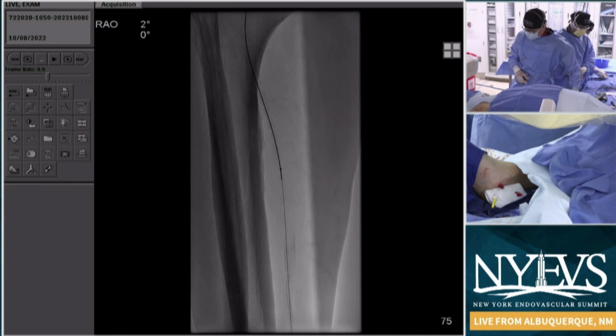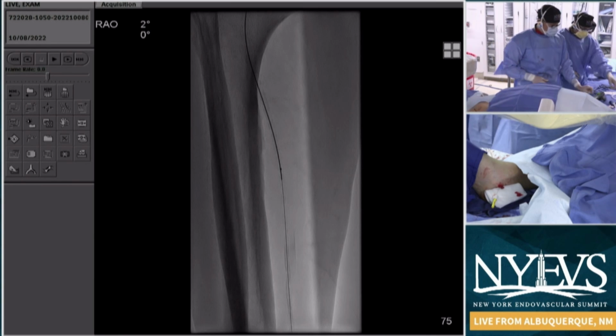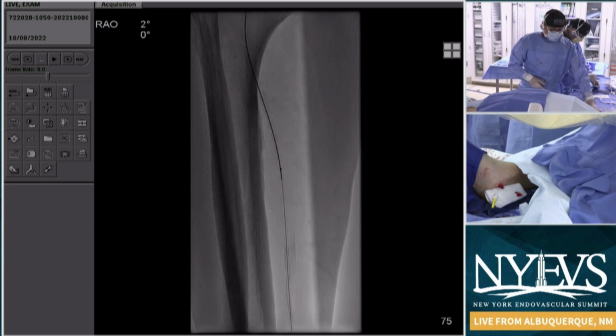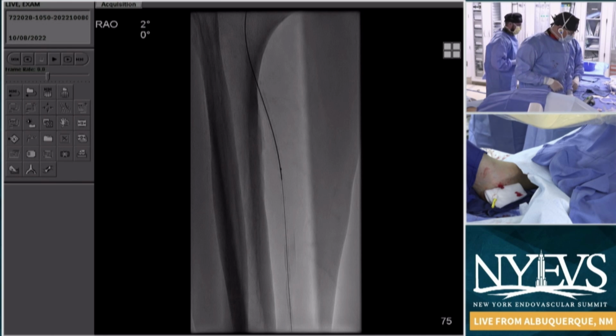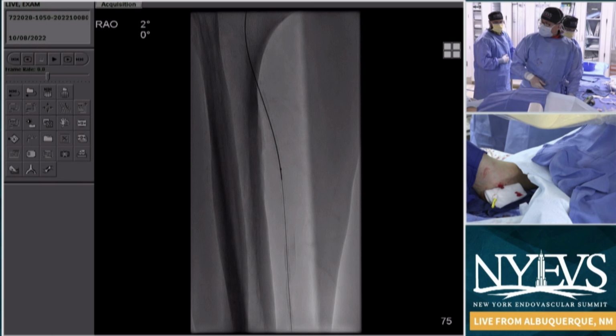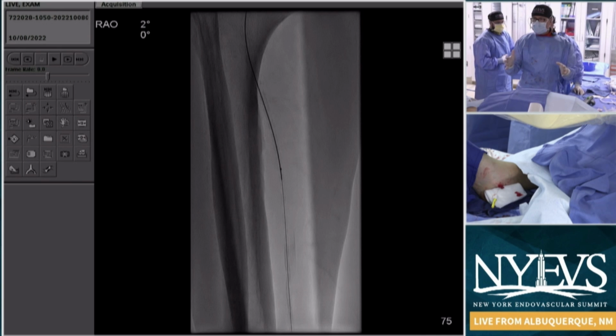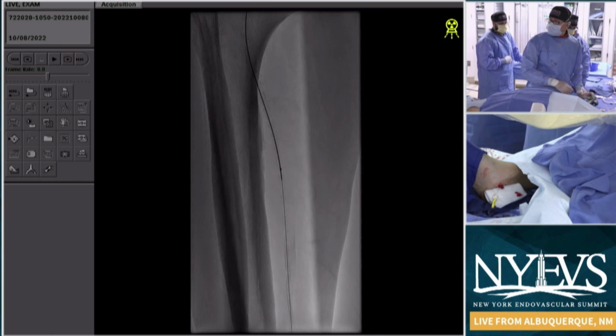Yeah, I think that may be the punchline. I wouldn't necessarily sell myself short as I'm done. Once I get through this AT, we've got some more potential stuff. So if I can avoid opening up multiple devices and use the full capacity, right? So we start at 60, go to 90, and ultimately 140 RPMs. That's the beauty of orbital atherectomy, that you can dial it up, and then we'll post-dilate. But I still feel like I'm going to end up having to do some work down into the pedal. So a 1.25 micro gives me one device that I can take care of the entire leg with. Anybody disagree with that? No, I think that's a good plan, Steve.